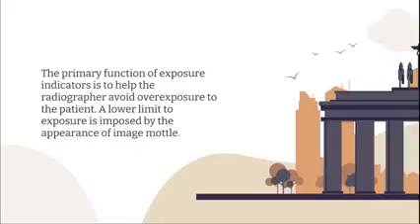Okay? So dapat naatay range ang mga radiographer na murag basehan na, okay, pagpasok sa ani na range, okay, good to go na ko, okay ang exposure sa pasyente. Because again, lisod kay achieve tong target na middle exposure value. Kasi murag isa lang siya ka-value na imong targeton. Okay? So, accuracy and preciseness is difficult to achieve with this one.